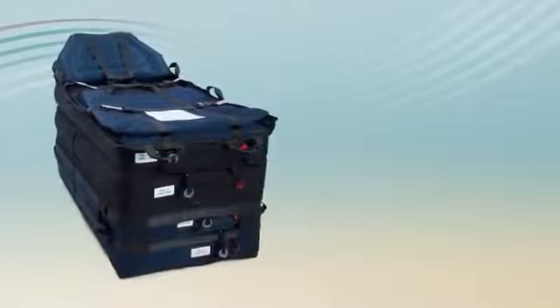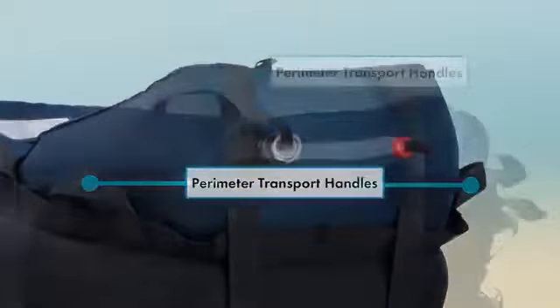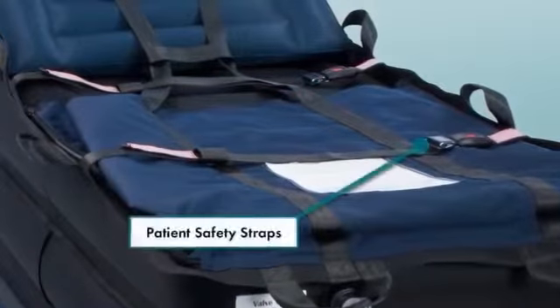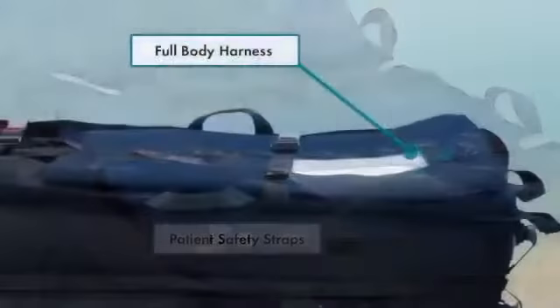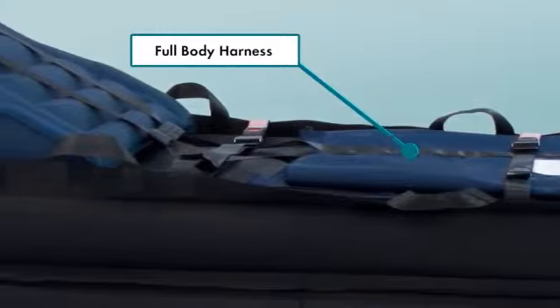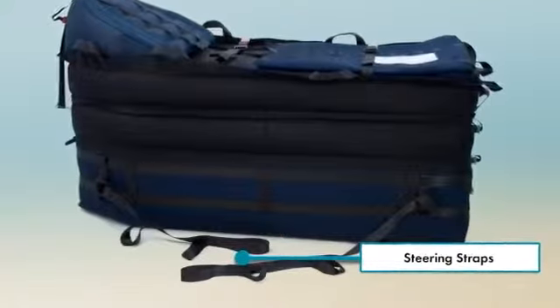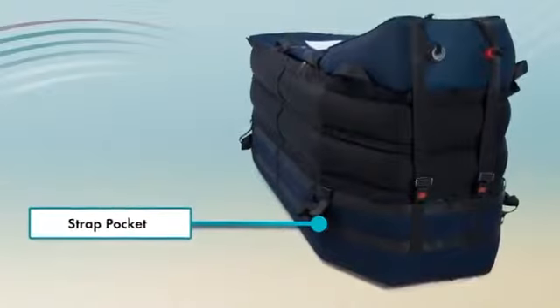There are 8 perimeter transport handles, 2 at the foot end, 2 at the head end, and 2 on each side. There are 2 patient safety straps, 1 at the chest, and 1 that secures below the patient's knees to prevent the patient's legs from buckling. The full body harness straps extend over the length of the Evacuation HoverJack 2 and buckle at the head end of the device. There are 4 steering straps, 2 at the head end and 2 at the foot end. The steering straps should be stowed in the strap pocket located on each side of the skirt when not in use.